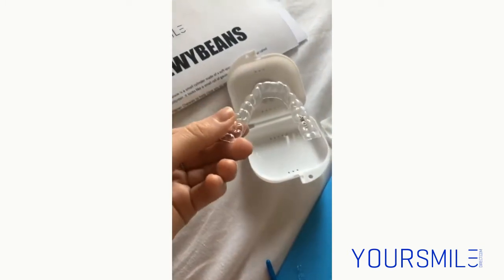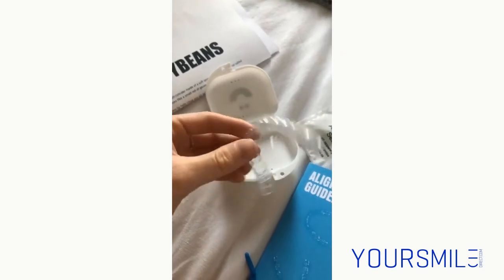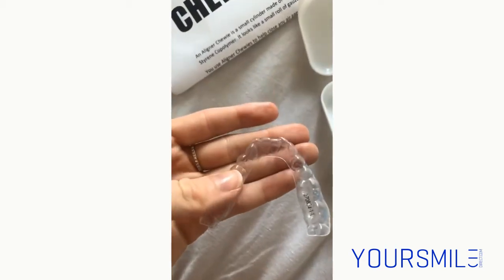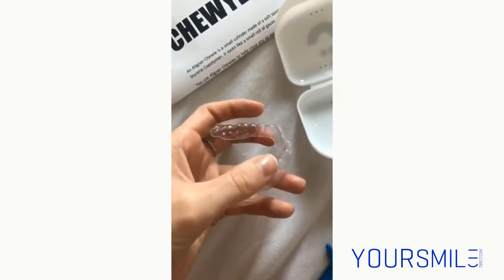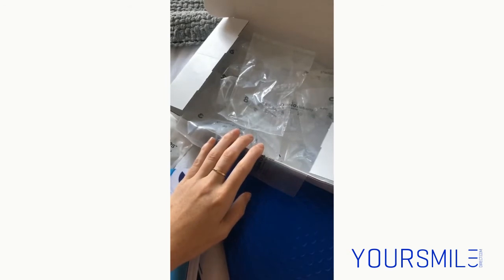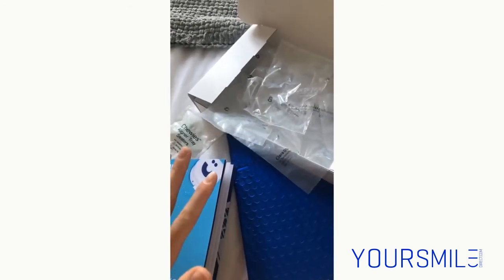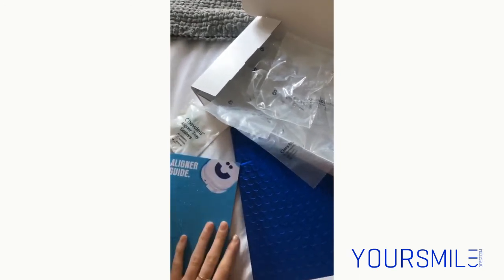This is like the impression of my teeth, and then this pops over my teeth, and I am to wear this every day. It's actually easier to show you the shape of my teeth with this. You can see where they're a little bit out of shape there. I have to wear this every day for at least 22 hours, so you only take it out when you're eating. Working through all these will take between 4 to 6 months in total, so that's my full treatment length. It's roughly about 2 weeks for each aligner. It just depends on how you react to them.